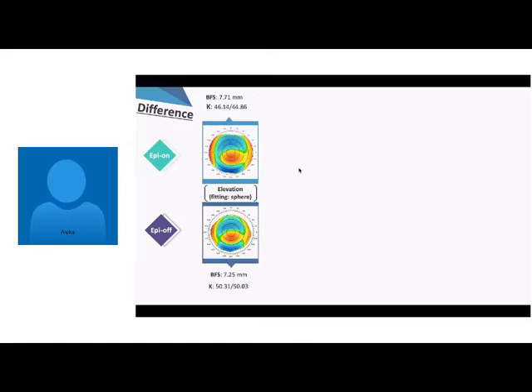And to put some numbers on it, again, I use some slides I got from Giuseppe from Procedure 2, which gives us on the upper row the normal elevation or anterior topography, and on the lower row, the stromal one, with epithelium electronically removed, which means that our epithelial map was removed from the anterior elevation map, and we got the stromal elevation map.